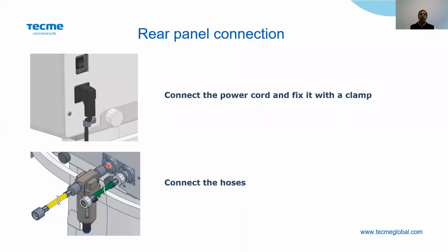They have this connector, the standard, an international standard. And they have different types of connector for air and oxygen. So these connections are different in order to avoid accidental connection: always connect oxygen in the oxygen inlet and air in the air inlet. In the air inlet we also provide as a standard a filter. This filter is going to filter the air that is going inside of the machine.